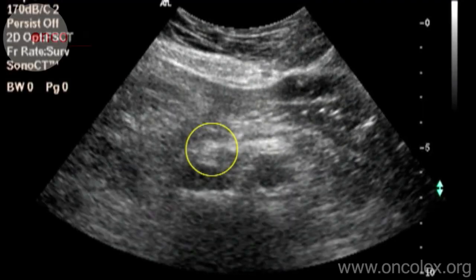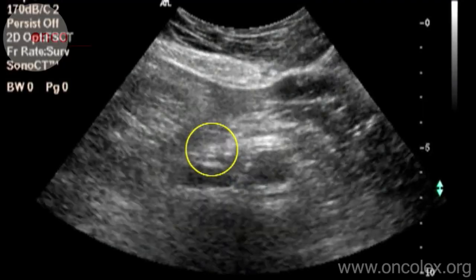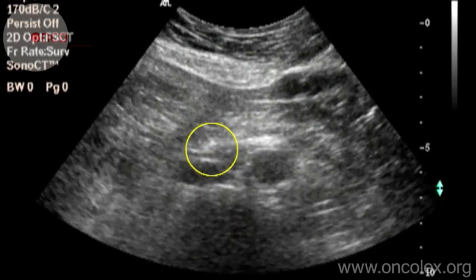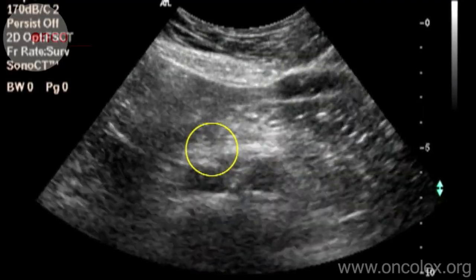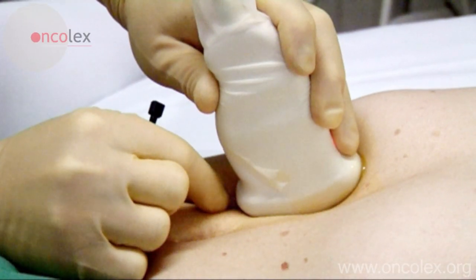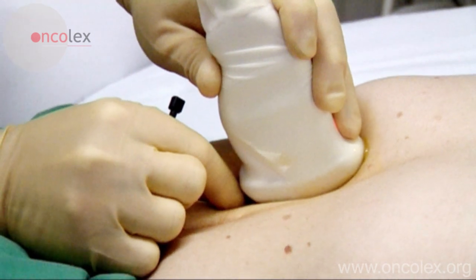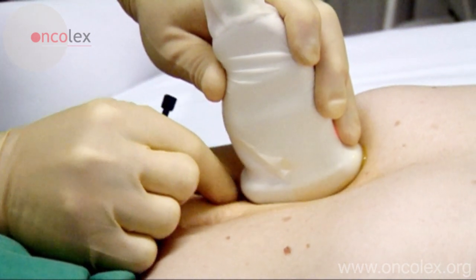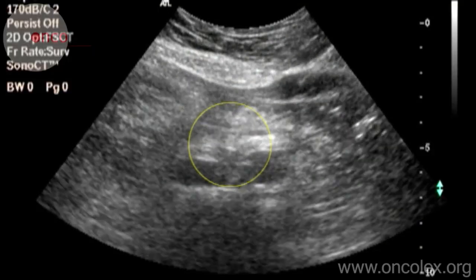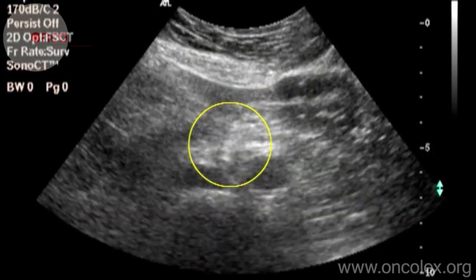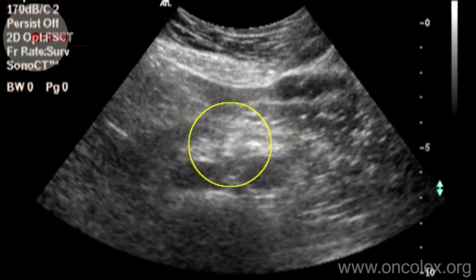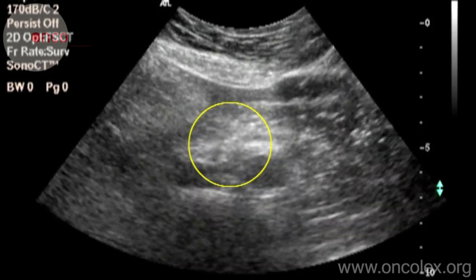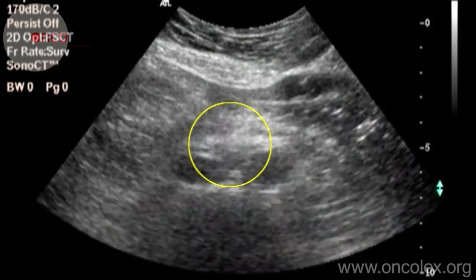The needle is in the lesion and the introducer is removed. The needle is moved back and forth two to three times a second. When the biopsy material is visible in the top of the needle, it is pulled out.